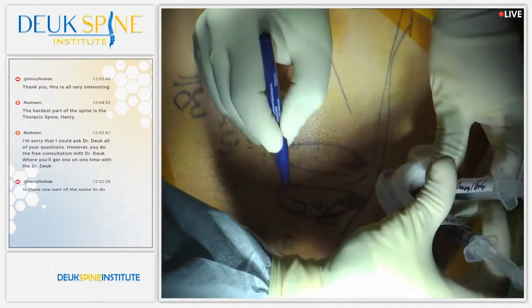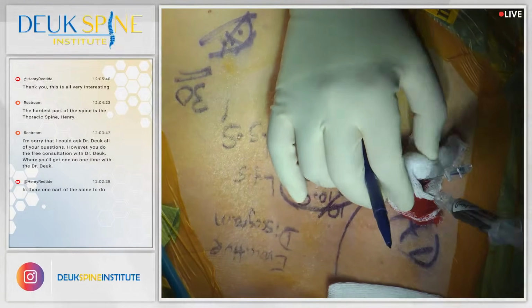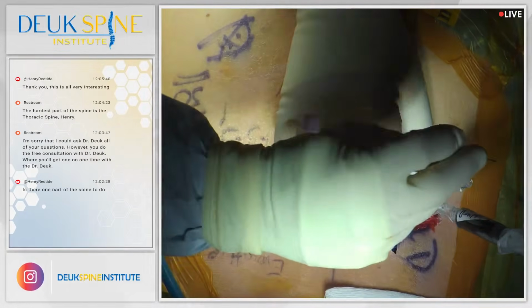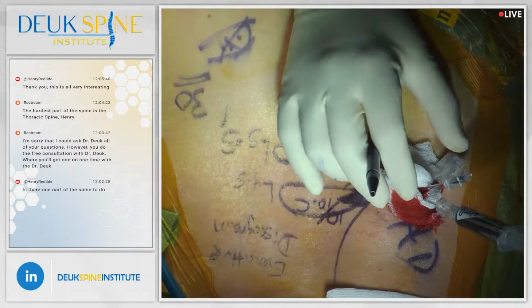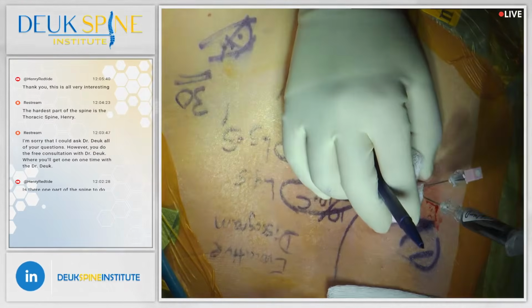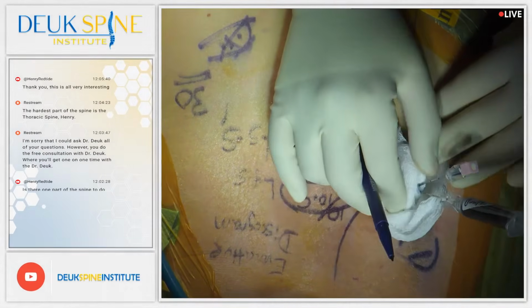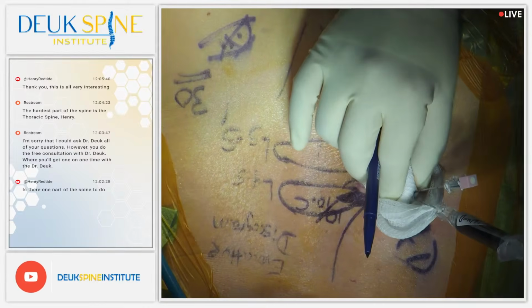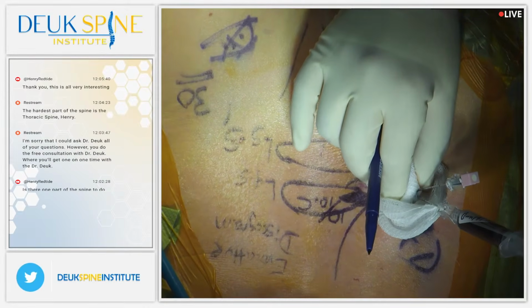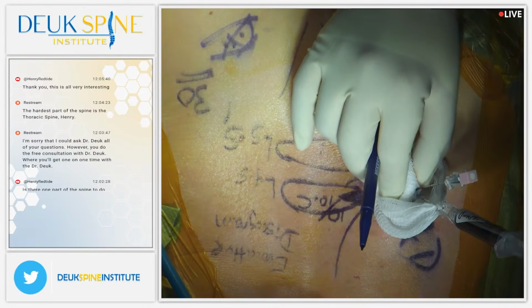That's where that pain's going to be gone when you wake up. Isn't that great? You're doing great. Just relax. We just tested the disc to see if it's causing pain. You did fantastic. What's that? I couldn't hear what she said. What'd you say? Is that a cat? Okay, we're good. You having any pain right now?